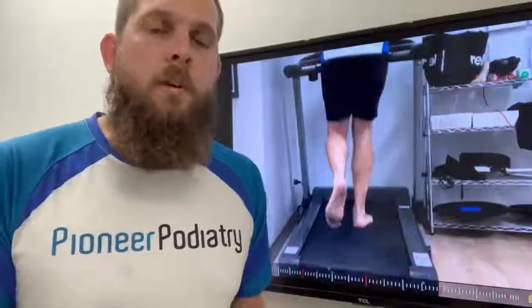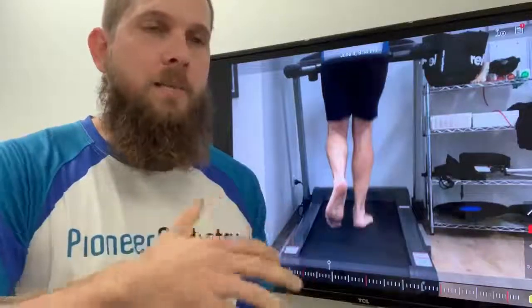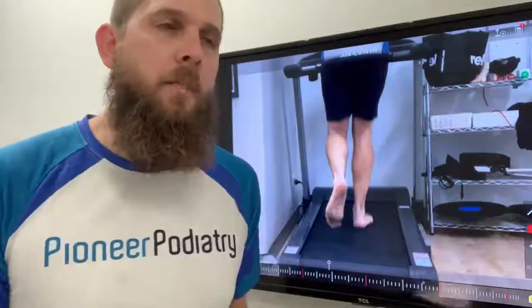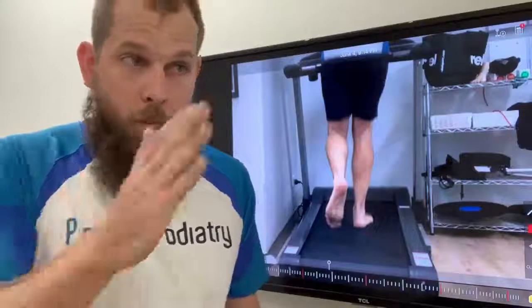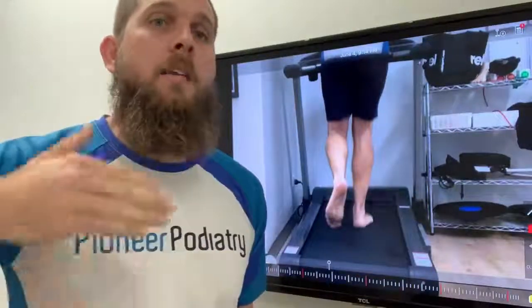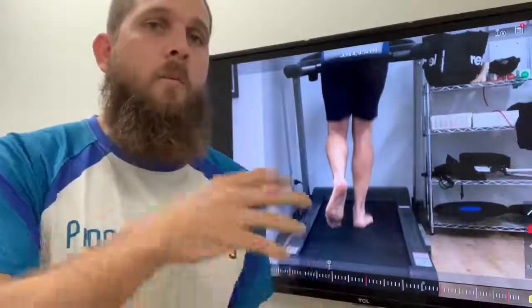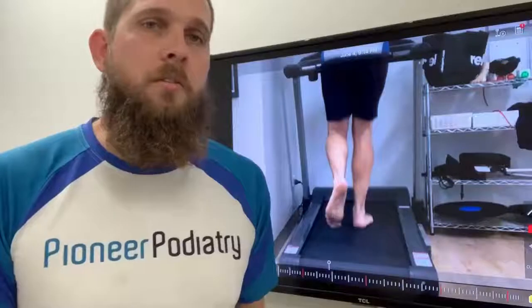The human eye can't really detect the things that happen at the speed that they're happening in the human body. So we use gait analysis all the time. We watch people walking, but to be able to stop it, pause it, and go frame by frame allows us to pinpoint where the movement problem is and why that could be contributing to your injury.